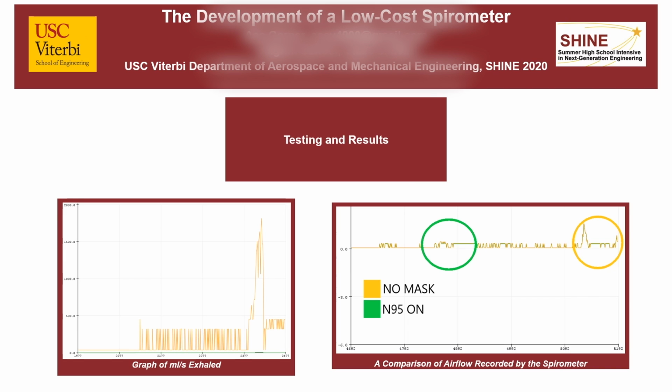Right now I'm at the point where everything on the spirometer is working fairly well, and I'm able to get some pretty interesting and useful data from it. The main way in which I focused on presenting the raw pressure data was through milliliters per second, or airflow volume. This was calculated by the code, which took into account Bernoulli's equation to convert the differential pressure into airflow volume, usable in metrics such as expiratory reserve volume and tidal volume of one's lungs.